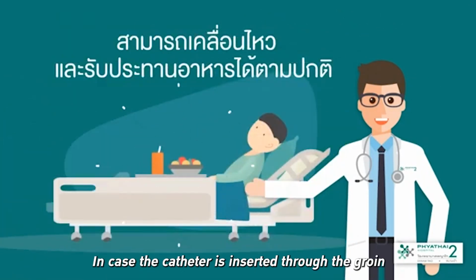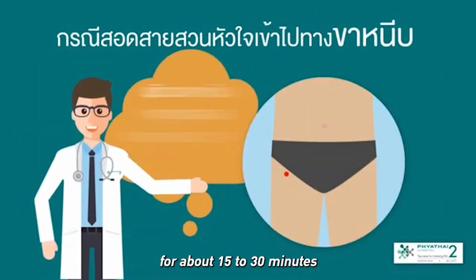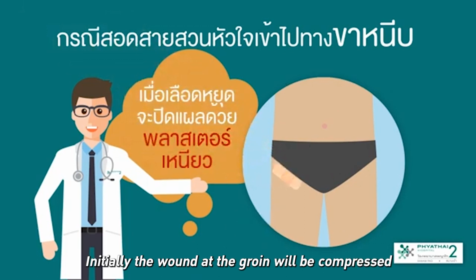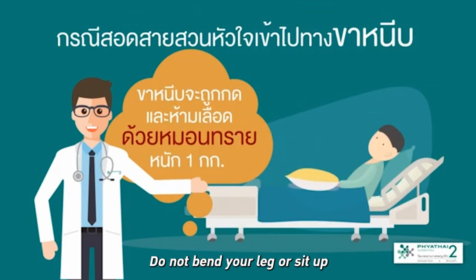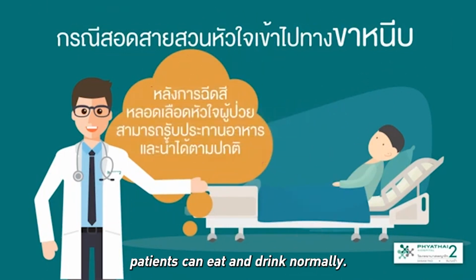In case the catheter is inserted through the groin area, it will be compressed to stop bleeding for about 15 to 30 minutes. When the bleeding stops, the wound will be sealed with an adhesive plaster to prevent further bleeding. Initially, the wound at the groin will be compressed and restricted with a sandbag weighing about 1 kilogram. Do not bend your leg or sit up for about 4 hours. After coronary angiography, patients can eat and drink normally.